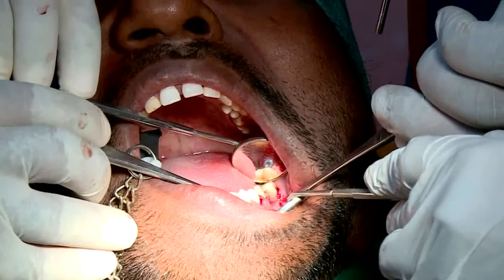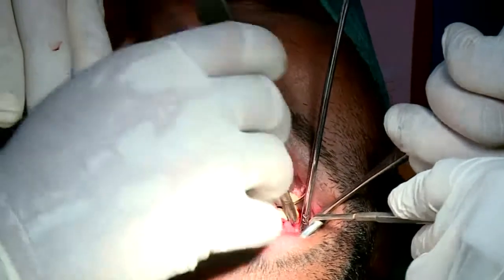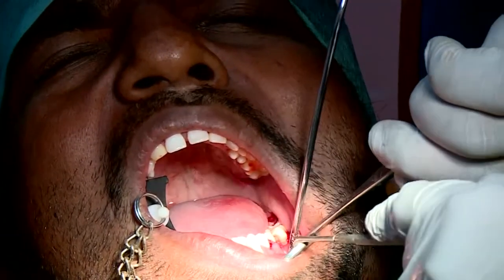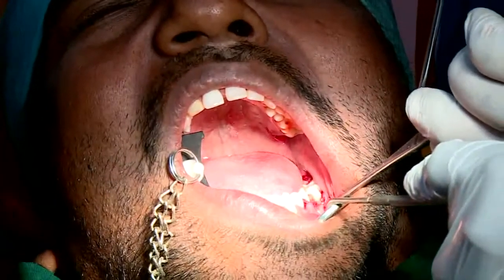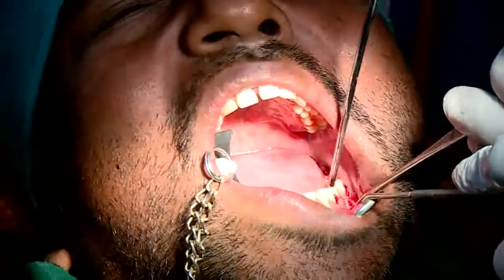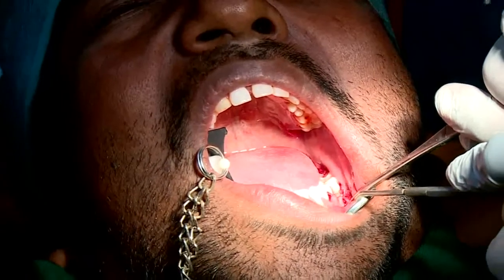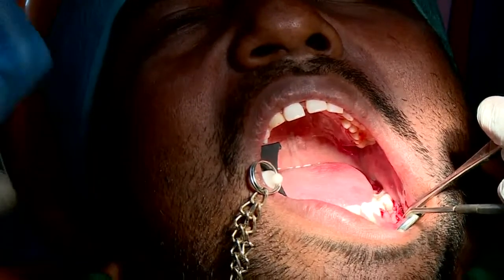So now, this has a fantastic primary stability. When we say primary stability, that's one of your keys to success. When you place your implant, if it is shaky inside the socket, the chances of that implant succeeding are extremely low. So when you are placing the implant, you are looking at an insertion torque of at least 30 newtons.